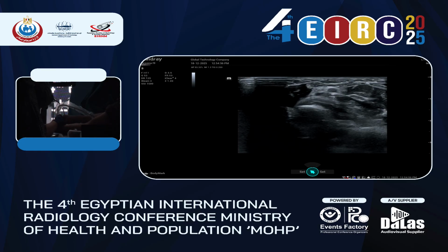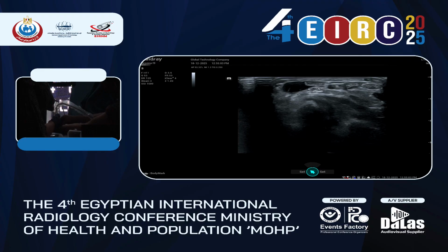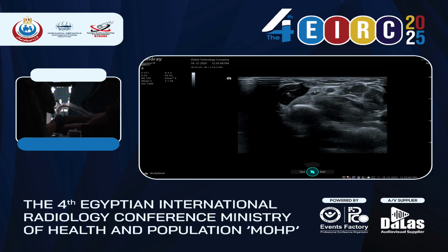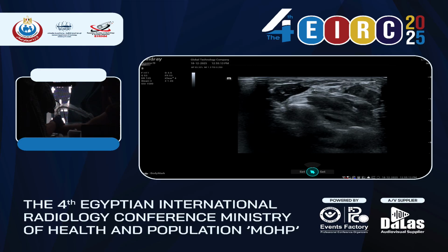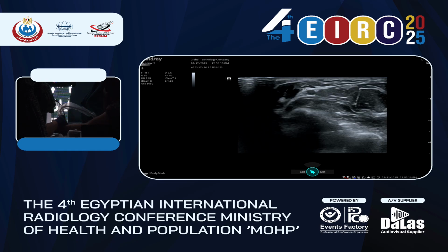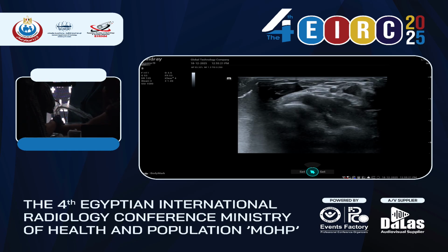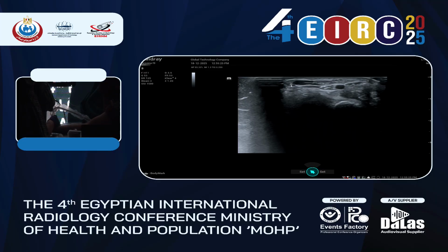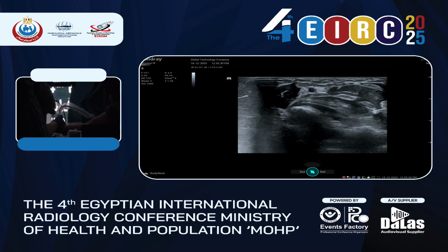At this level, we have the ulnar nerve, and there is a little branch coming out of the ulnar nerve. Actually, two branches come out of the ulnar nerve just before the Guyon canal. These two branches are the dorsal and palmar cutaneous branches. So two little branches which innervate the skin. They become superficial, and they innervate the skin of the ulnar side. You see here? They innervate the skin of the ulnar side of the wrist, the palmar and the dorsal cutaneous nerve.